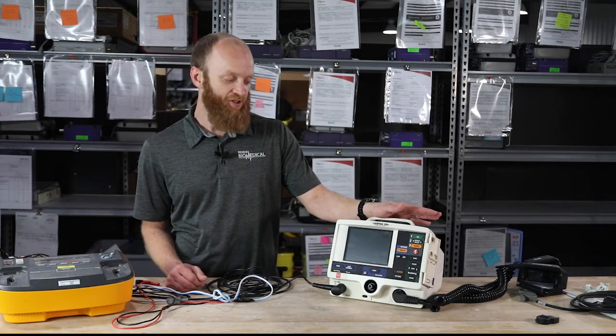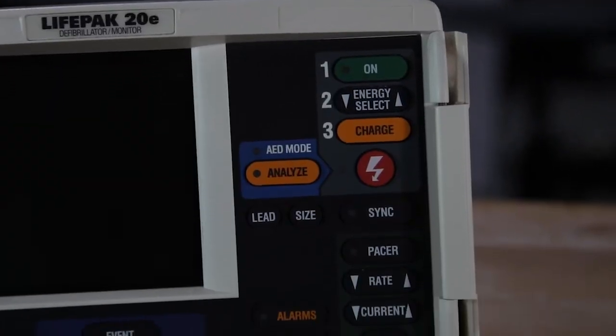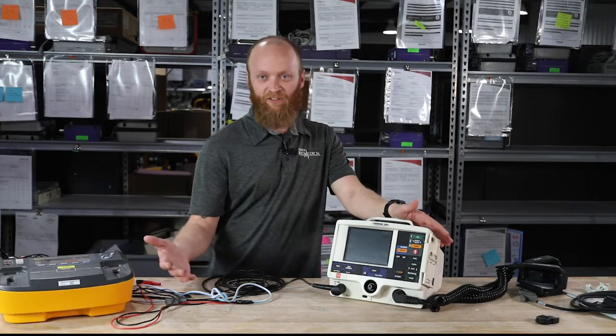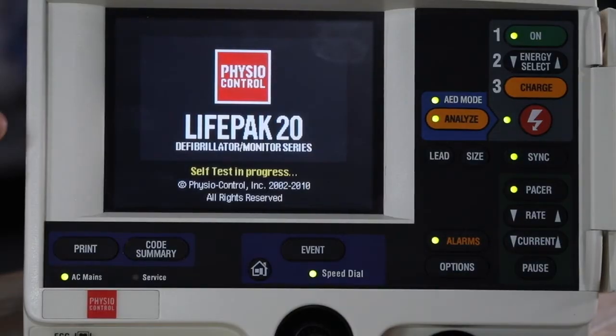There is no blood pressure monitoring. If you want to monitor end-tidal CO2, you have to purchase a code management module for the bottom. You can then monitor end-tidal CO2, plug in your filter line or nasal cannula, and it's ready to go.